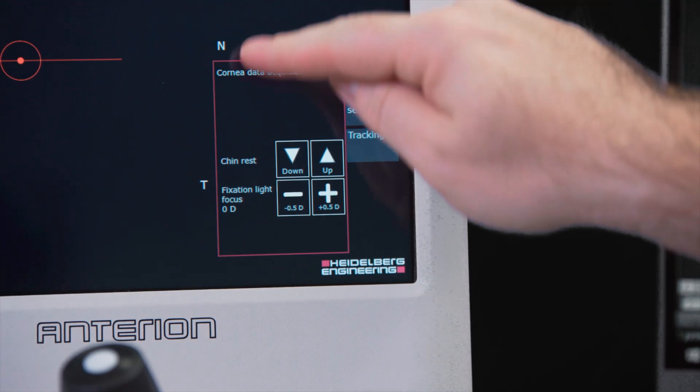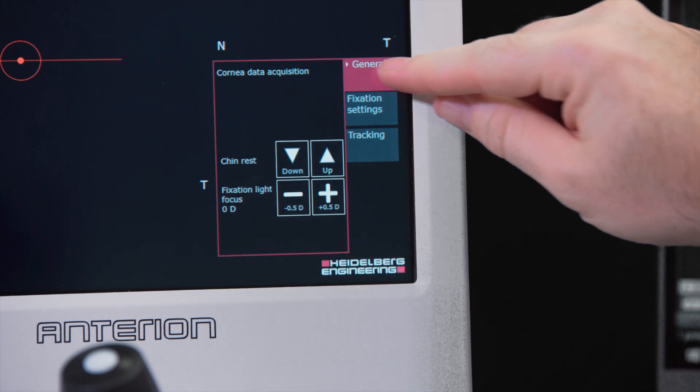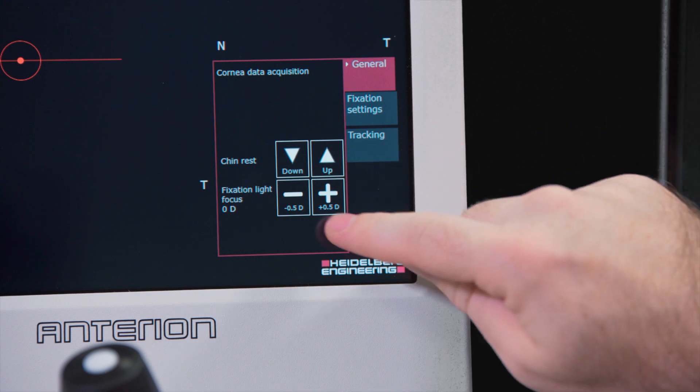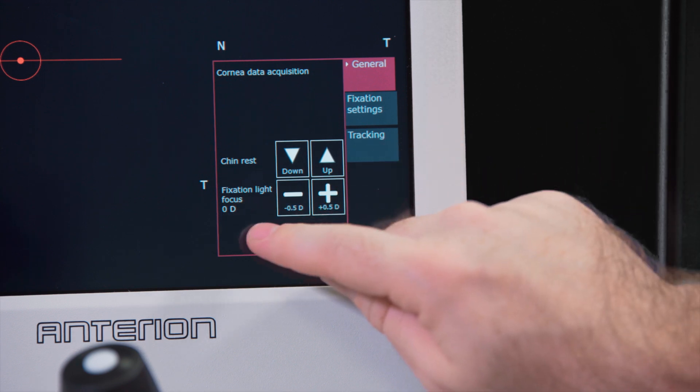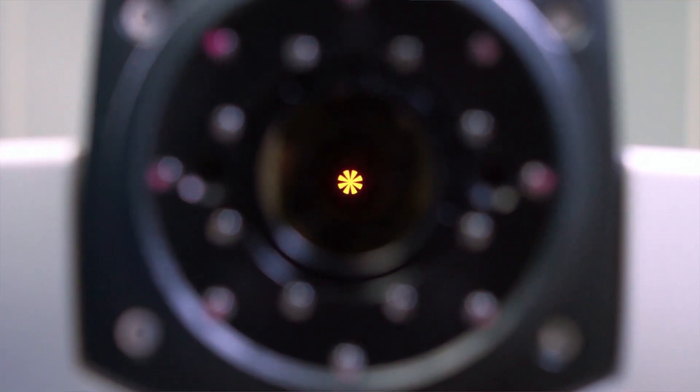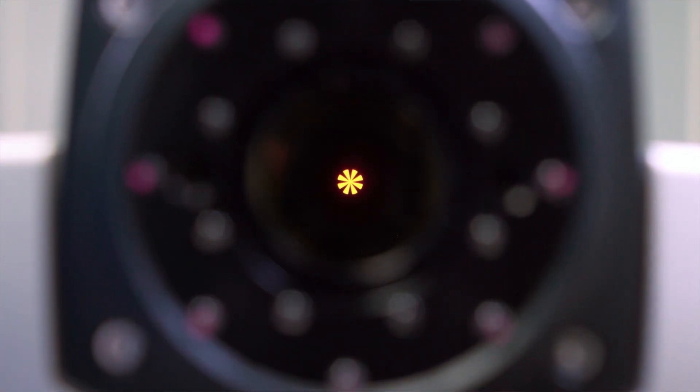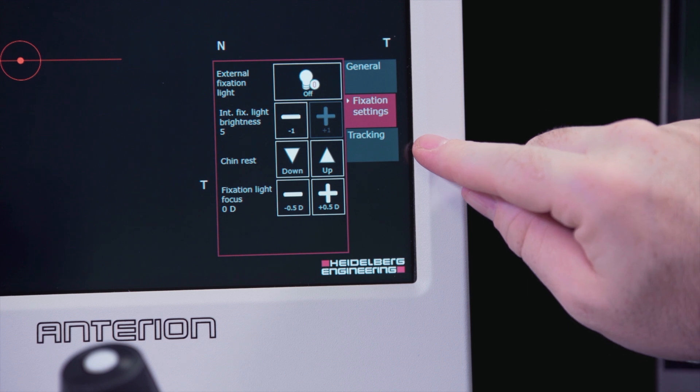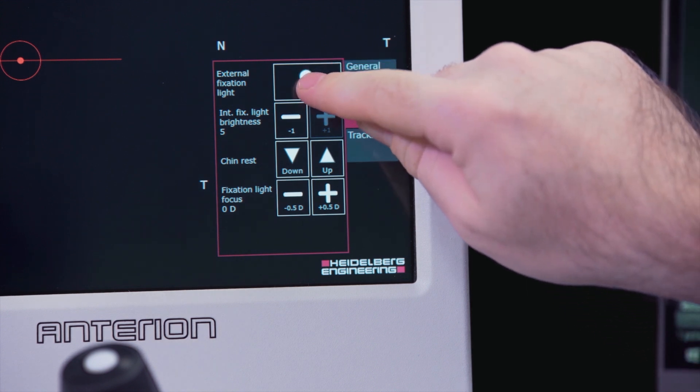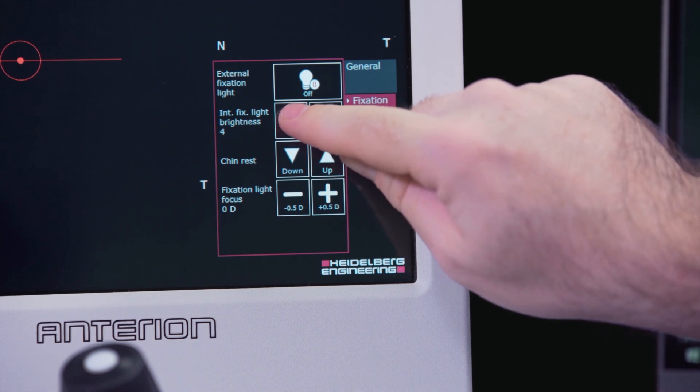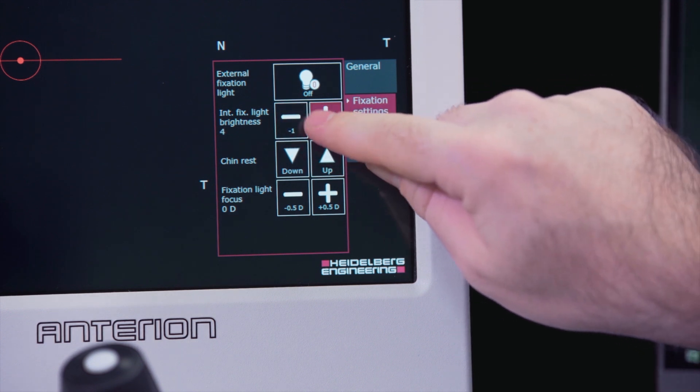The general tab on the touch screen has extra controls for the chin rest and for the fixation light focus. Ask the patient whether the internal fixation light is clearly visible while the camera is adjusted. The fixation settings tab has the button for toggling the external fixation light on or off and changing the brightness of the internal fixation target.